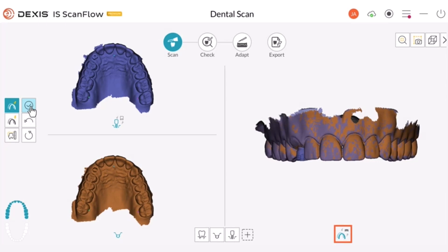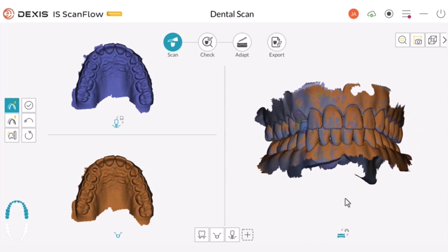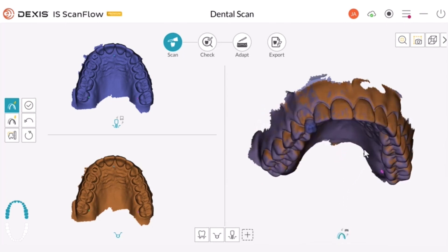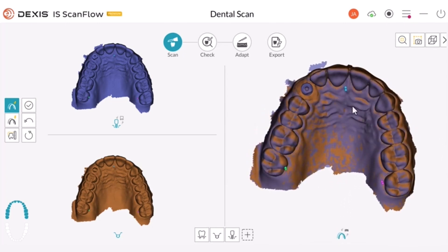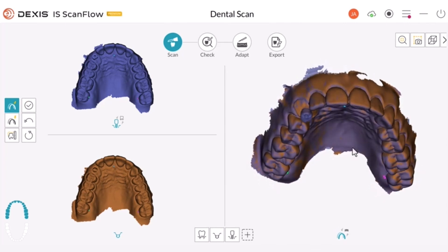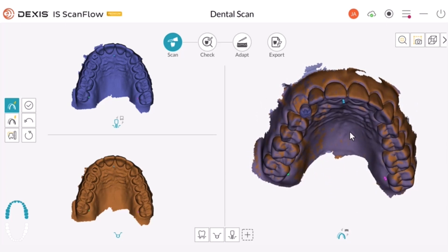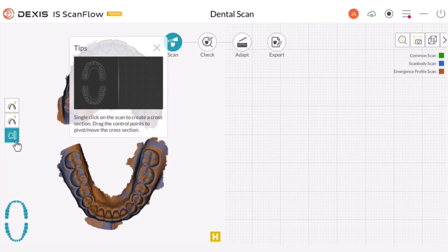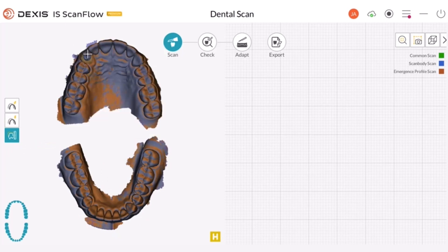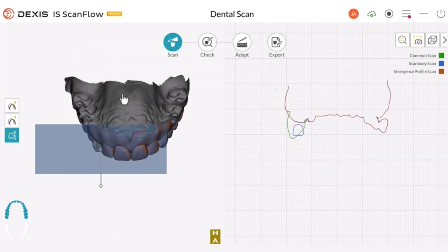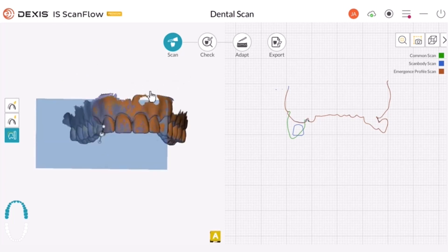Click the Byte Preview icon to toggle the preview. Rotate to check your scan. Now click the Preparation Check icon. Preparation Check allows clinicians to make measurements on the digital model and to check for sufficient clearance and alignment of scans.